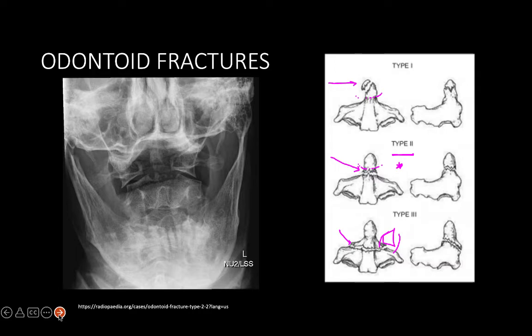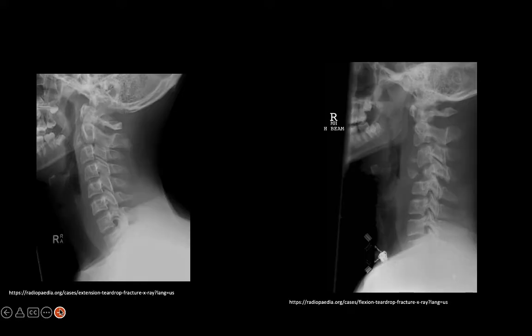These are usually patients that violently hyperextend. So you think about like a face plant type of fall can commonly fracture the dens in this pattern. You'll notice on the radiograph a discontinuity along the margin of the dens. As we get about here, you'll note a lucency crossing the dens. You'll note just a general lucency in this region, and also some evidence of comminution. Now, if you're not sure, the next best test to order is a CT examination. Whenever we're not sure about osseous findings, computed tomography is really the best way to go.